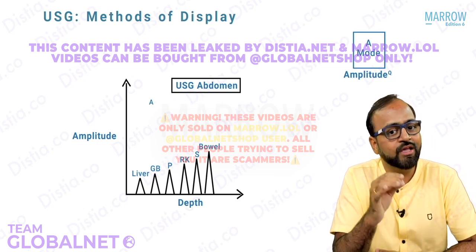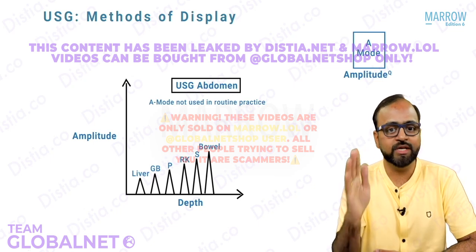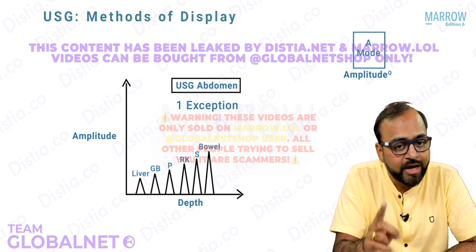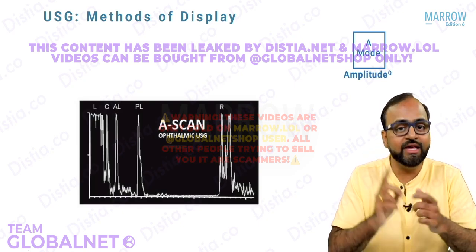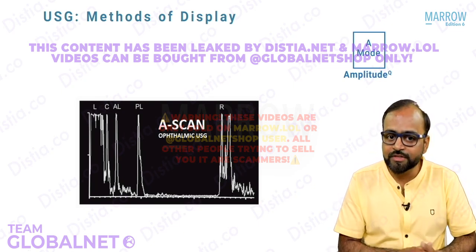And therefore remember, A mode ultrasound is not used in human diagnostic imaging, except that it is used even today for imaging of one particular organ in the body. And what is that? Anyone? It is used for ophthalmic ultrasound. In eye ultrasound, you have an A scan and a B scan, right? What is A scan? It is nothing but the A mode of display.